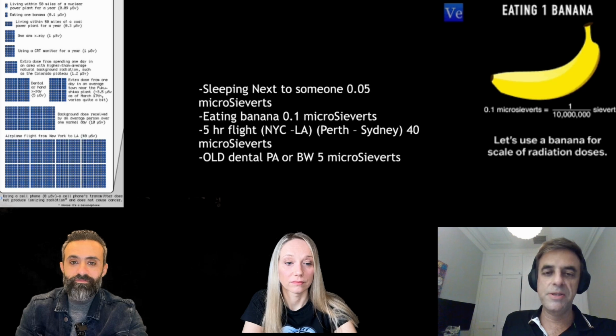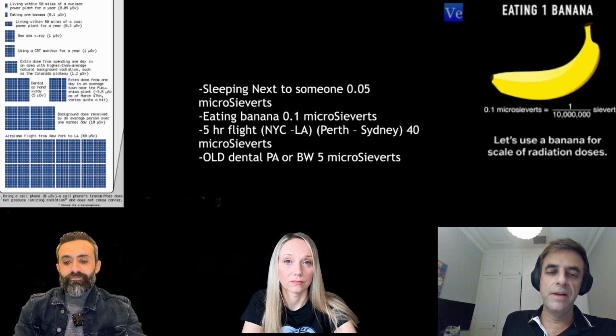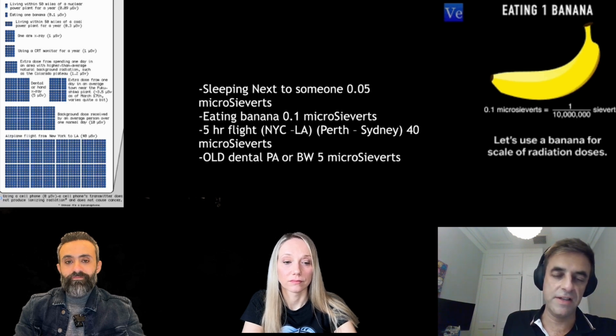So that puts things into perspective, and I feel that radiation now is a big talking point in our profession, because before it was sort of we try and do as little as possible, but now we know that radiation isn't quite as harmful as we thought it was, and the benefits are huge for the patient if we can get better information and treat them more efficiently and also save their time. So it's actually a really, really good talking point.